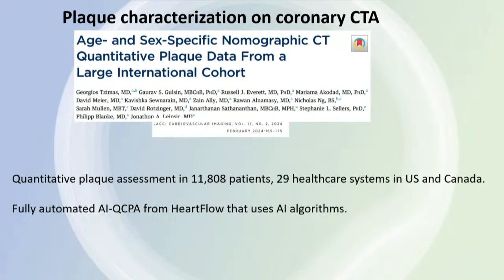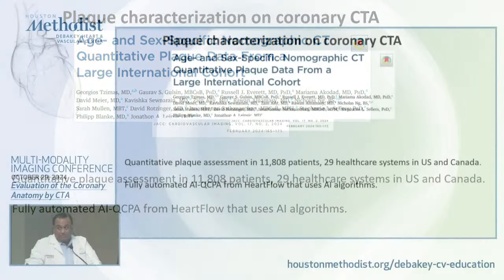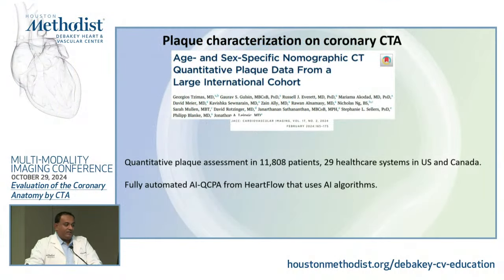All right, do we have normative data? If we're going to start reporting this on our CT reports in future, do we have normative data on plaque volumes? And we just got it this year. This is a study from 2024 in JACC Cardiovascular Imaging from Dr. Lipsick's group. They looked at quantitative plaque assessment in 11,000 plus patients from 29 healthcare systems in US and Canada.